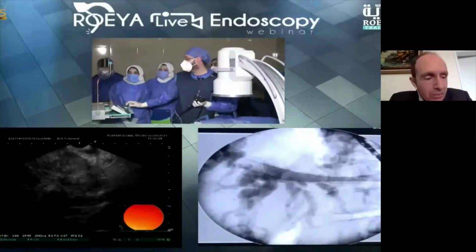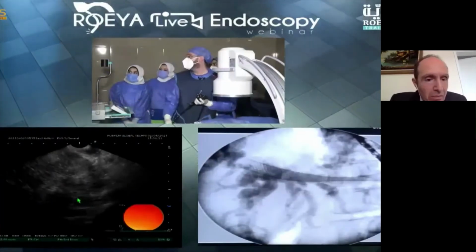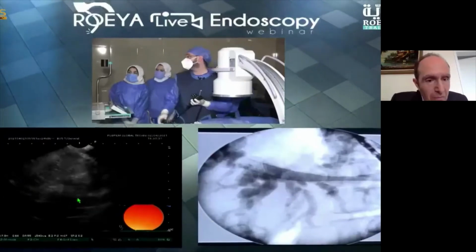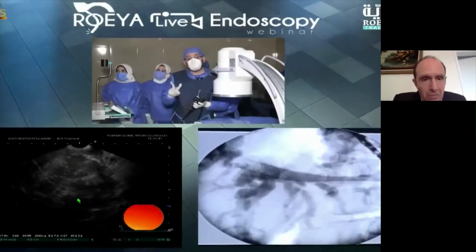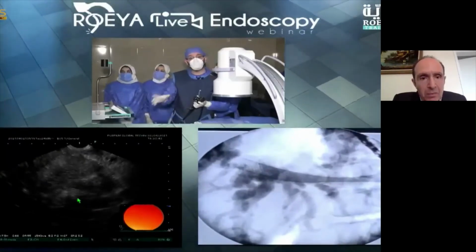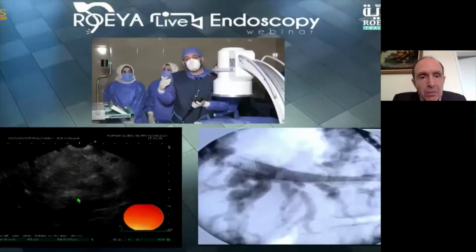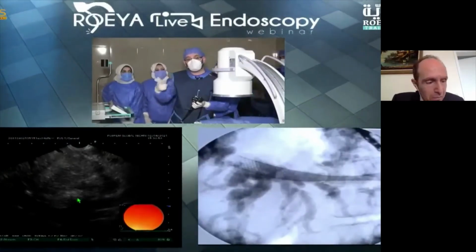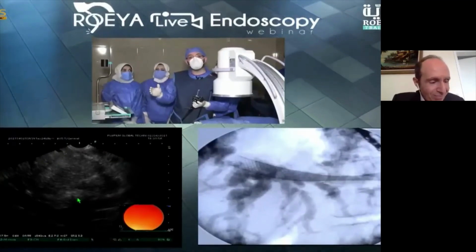Now we can see the gallbladder mass. I will point the arrow at the gallbladder mass, this large one. As we have here left lobe infiltration, and we have infiltration of the liver. We will perform FNB for this patient, 2 passes. We do the fanning technique using slow pull usually as a start. If we don't have enough tissue, we go for suction. Also, the patient is complaining of pain, so we can also do a CPN, although it's not of that much benefit for gallbladder, but we will start by doing FNB.